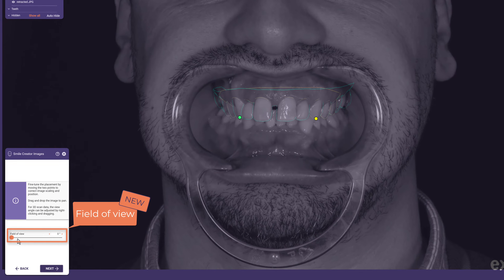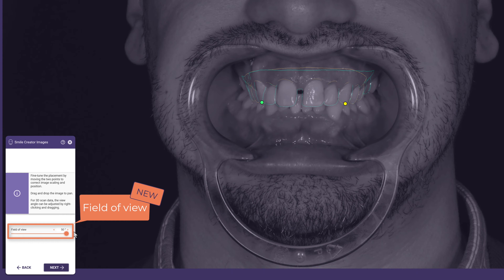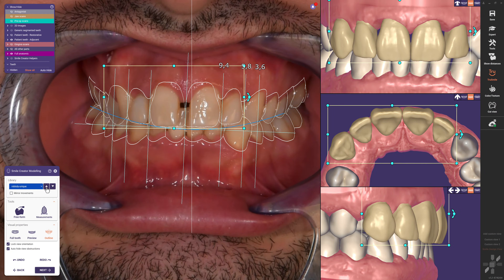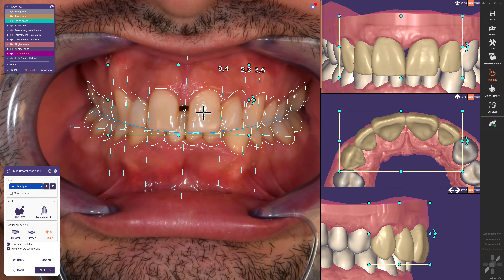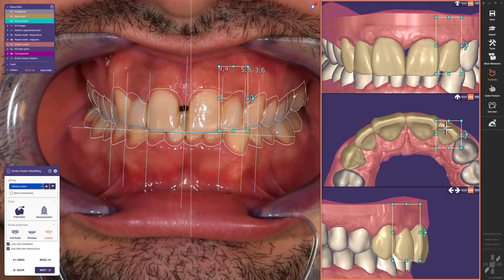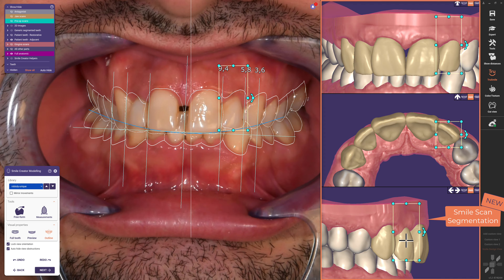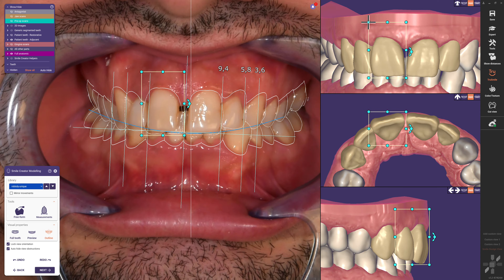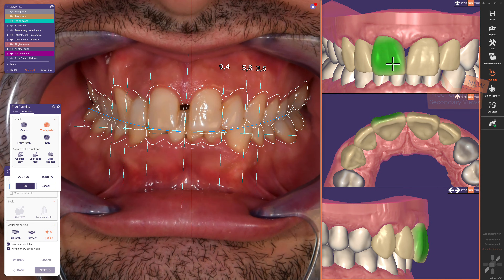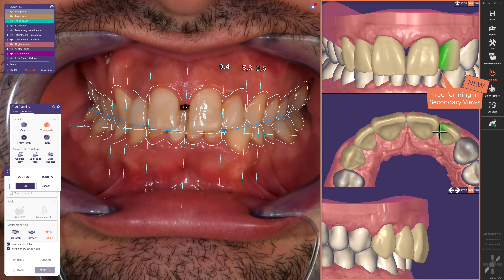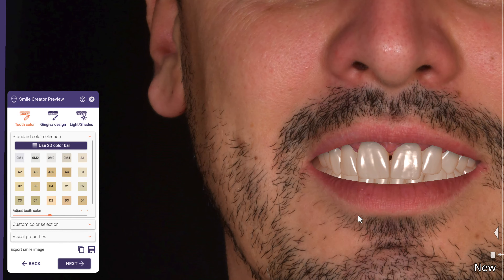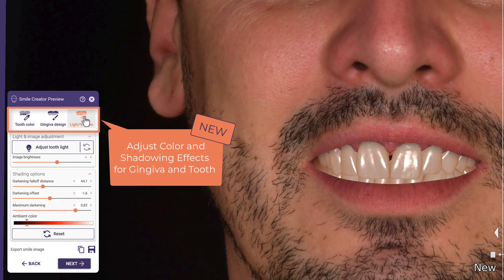Thanks to the new Field of View slider, it is easy to handle different camera and lens characteristics, resulting in a more accurate alignment of the patient photo. We improved the SmileCreator once more with this release by enhancing visualization and preoperative treatment planning. The Exocad cloud feature makes it possible to automatically segment all teeth from the gingiva to easily design smiles based on the patient's original dentition. Color and shadowing effects can also be adjusted to match the visual environment in the patient's mouth and present a more realistic outcome.